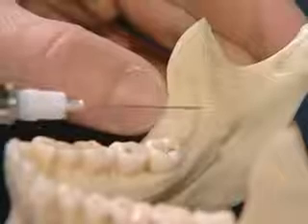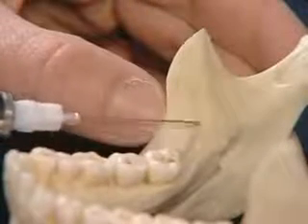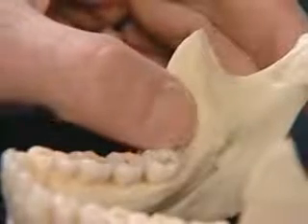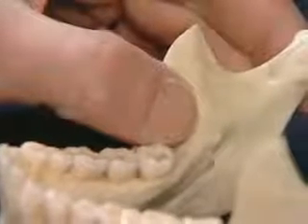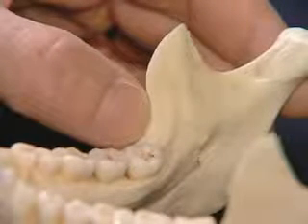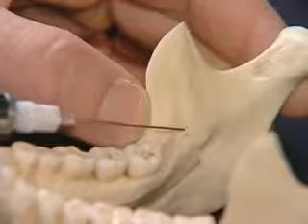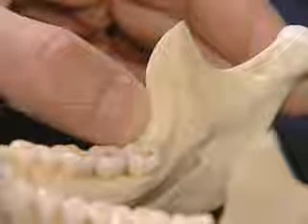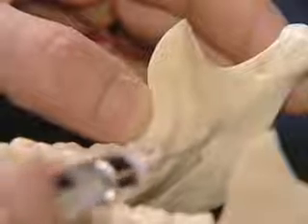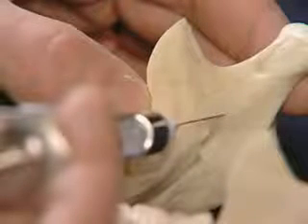The next stage is to palpate the internal oblique ridge, which is the next prominence as you move your finger or thumb in medially, and that should be palpated, a mental note made at that point, and then your finger or thumb again withdrawn laterally, pulling the soft tissue landmark with you. It is just medial to the internal oblique ridge that the needle will be inserted. At this point, you're ready for needle insertion. The needle is advanced just behind the lingula until it hits the mandibular sulcus. It is at this point that the mandibular nerve inserts into its foramen.